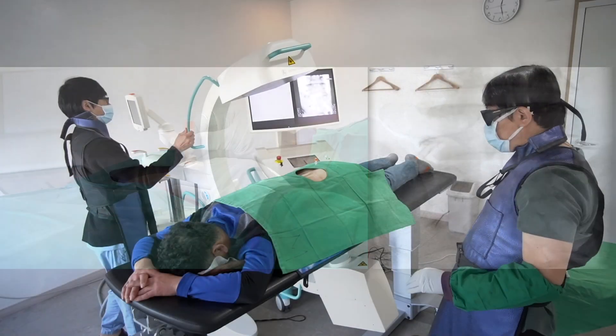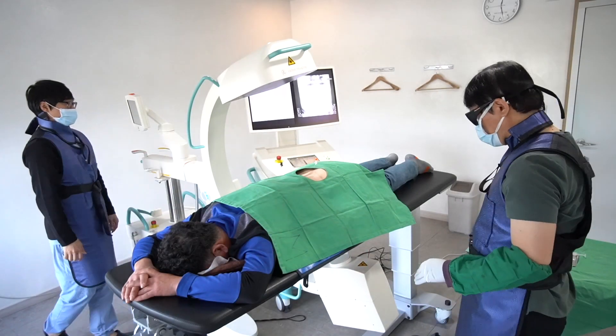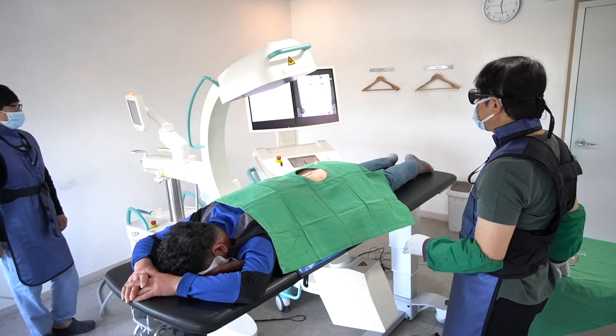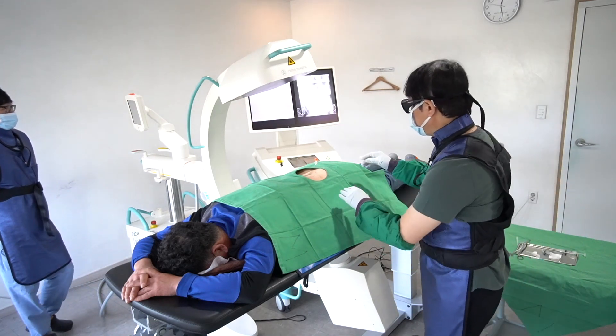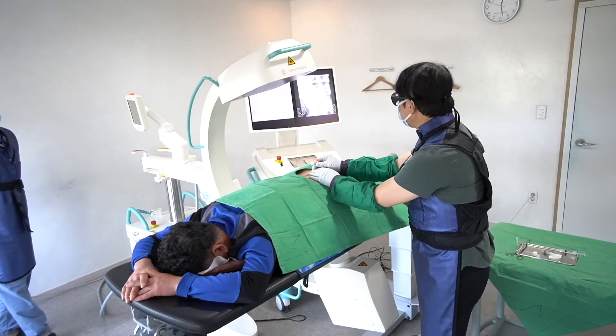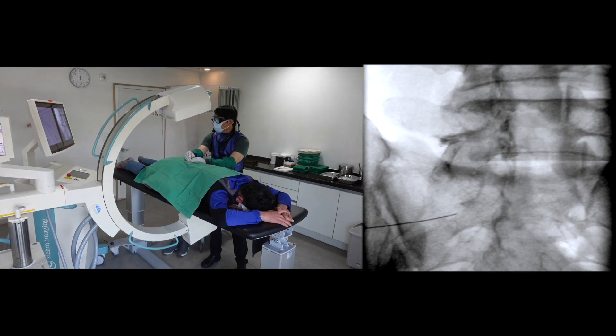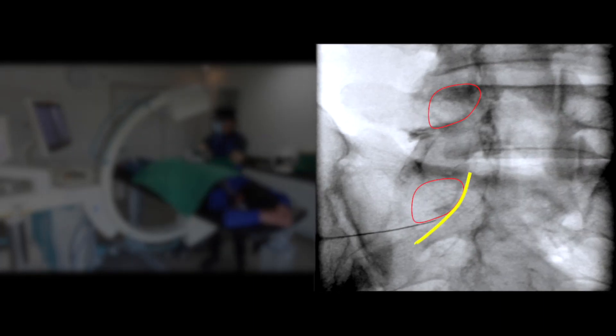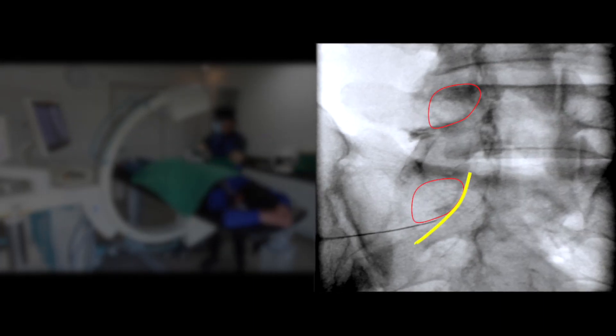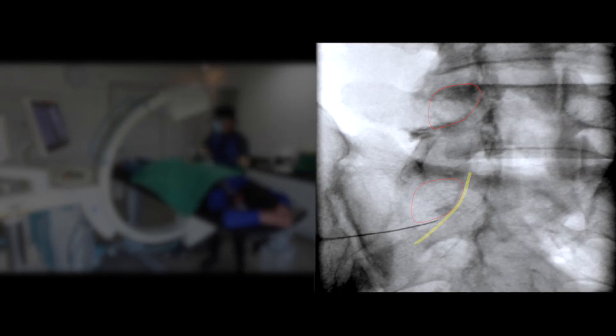Rotate the C-arm to the Contralateral Oblique position. Find the pedicle and the yellow line below the pedicle of S1.